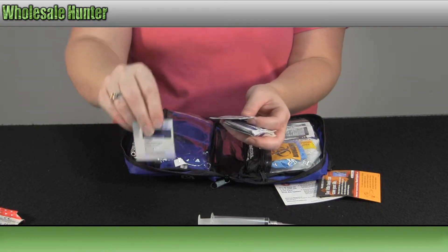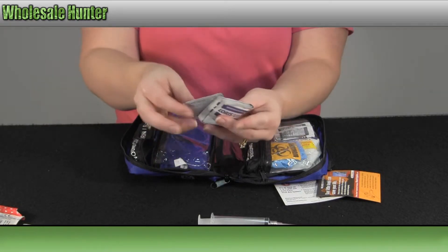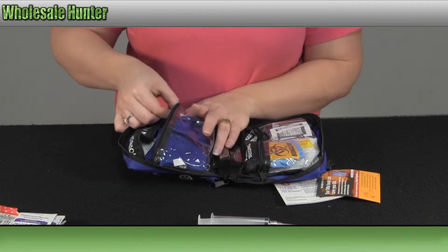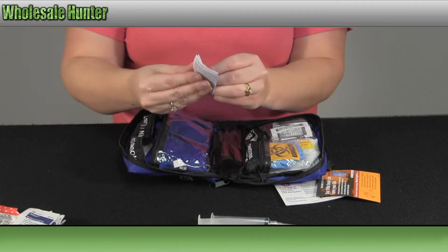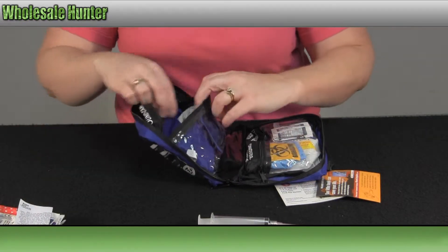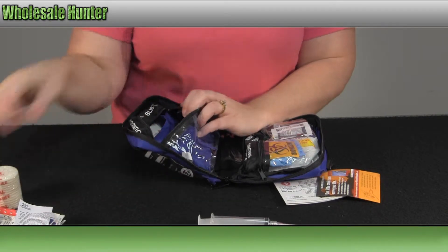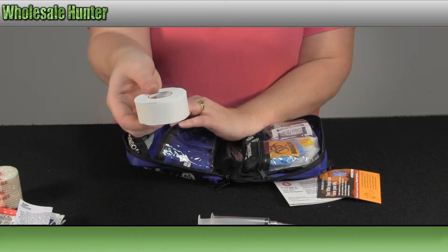Here you have an alcohol swab, your antiseptic wipes, and also another alcohol pad. And more information on your kit. You have a roll of latex free bandage and 10 yards of medical tape.